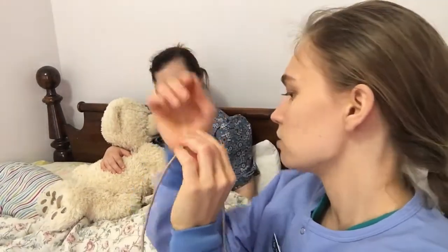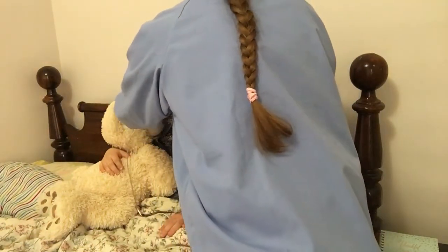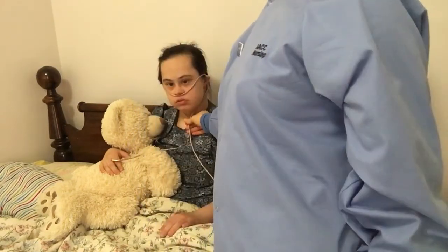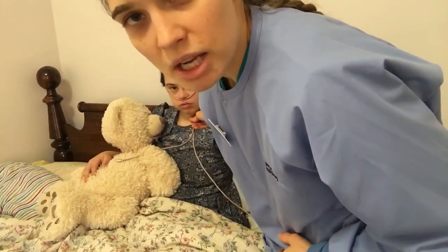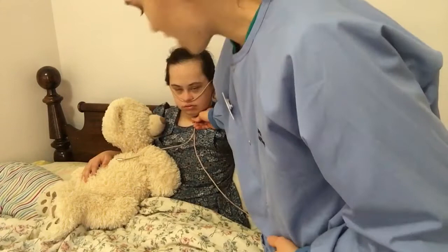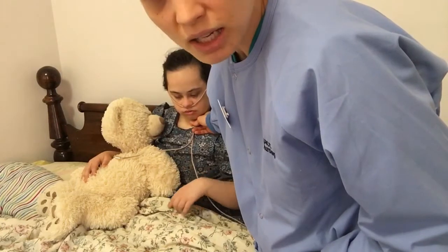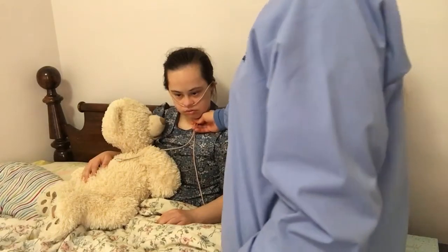First I'm going to test it and make sure the oxygen is coming out against my wrist — and it is. So I'm going to carefully place it beneath my patient's nose and behind the ears. There's a little piece here that brings it close to the chin; I'm going to be careful not to pinch my patient's chin. I would use foam pieces to prevent skin breakdown in any area where the oxygen tubing is rubbing against the skin. So that's the nasal cannula.